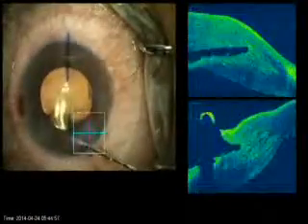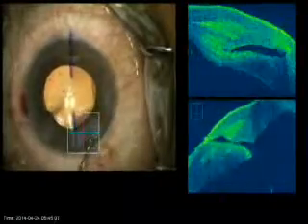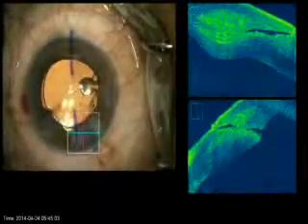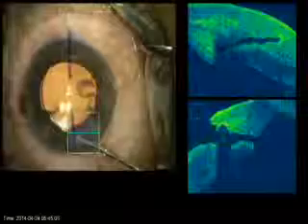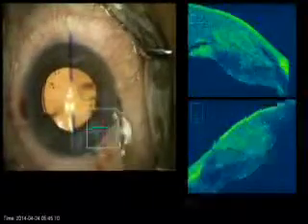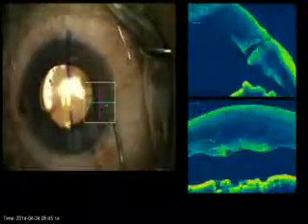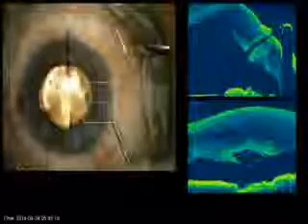Real-time OCT monitoring showed gaping of femtosecond-assisted corneal incisions after the end of phacoemulsification and IOL implantation. This reinforces the fact that, whether the incisions are created with femtosecond laser or manually, they have to be hydrated to achieve adequate apposition.